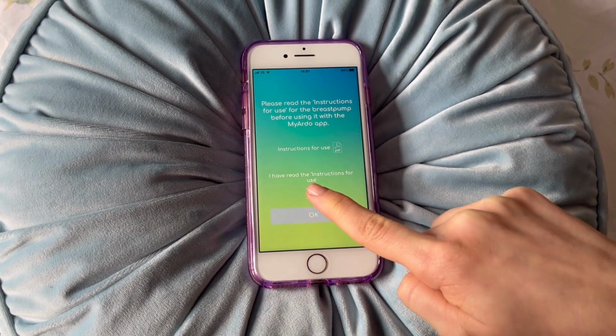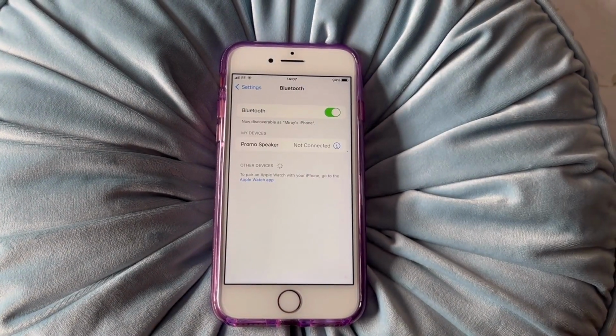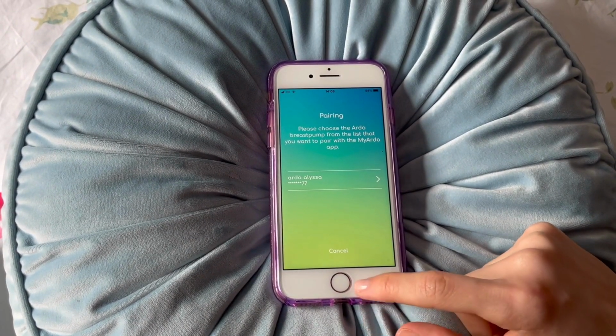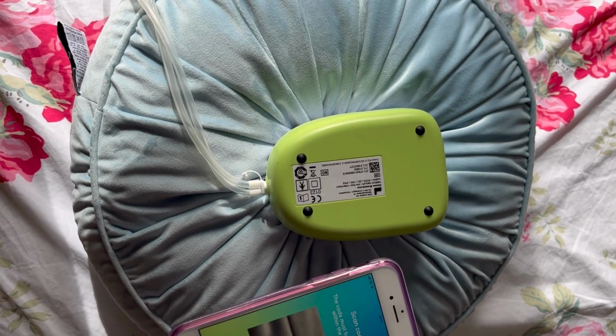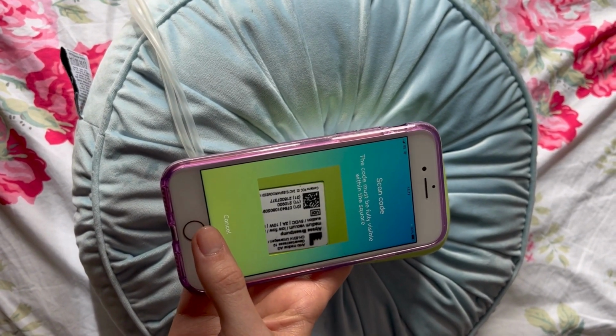Just tap the link. Tap OK. Turn on Bluetooth on your phone, then turn on the Ardo Alyssa. On the app, swipe left and tap enter. Select your breast pump. You need to enter the serial number which is found on the back of the pump or on the box. It is a number with 21 in brackets. You can also scan the QR code with your phone camera.